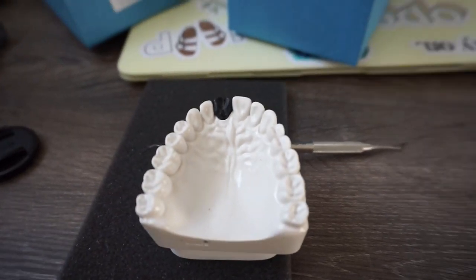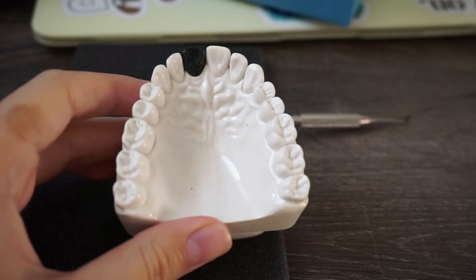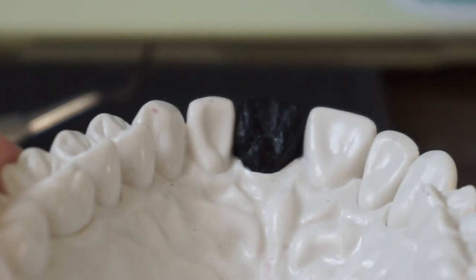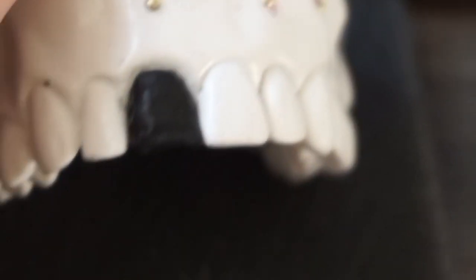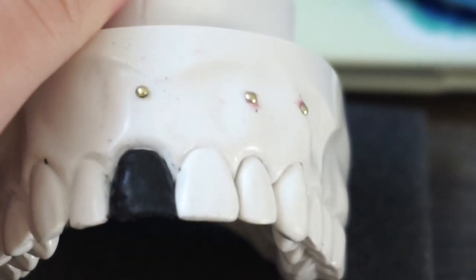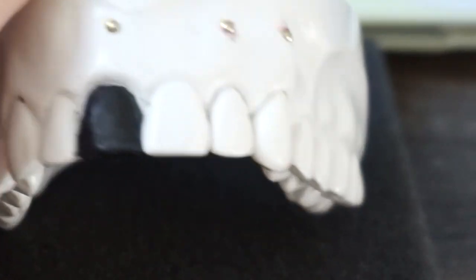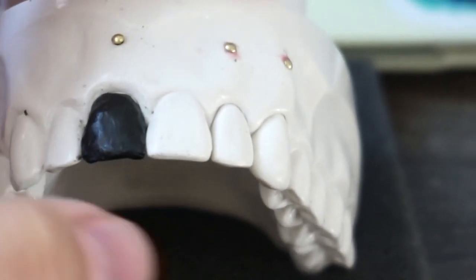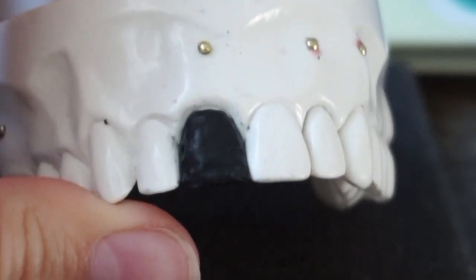So I just used some tips from my roommate, actually. This camera doesn't like to focus really close in. Yeah, I adjusted the cingulum a little bit more just to try to smooth things out. And then again on the front, I just do not understand how to get the little grooves, so I'm just leaving it totally flat, and hopefully today when I go in they can help me figure out how to do that, because there's supposed to be a groove here and here. So I'm just gonna go in and see if they can help me.